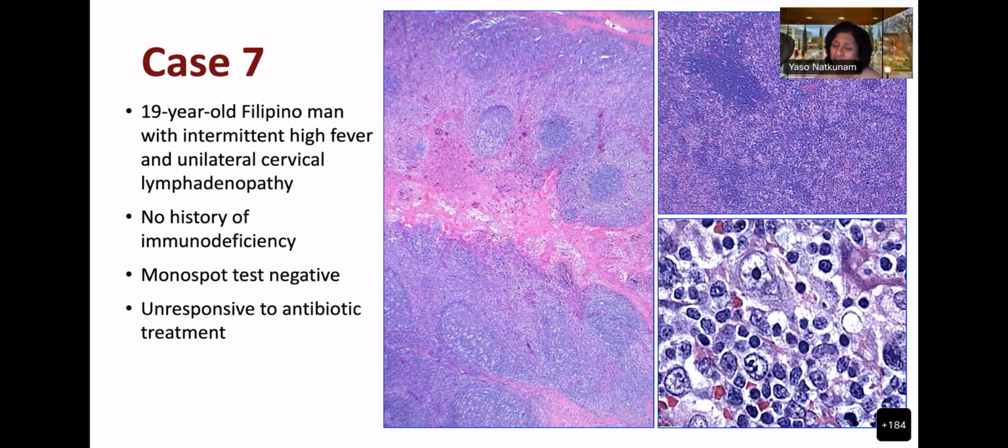I mean, could this be diffuse large B cell lymphoma? In pathology, if somebody says, could this be something, the answer is always yes, because it could be, right? You're always thinking of the exception. So that was a bad question. It could be, but it would be pretty rare.